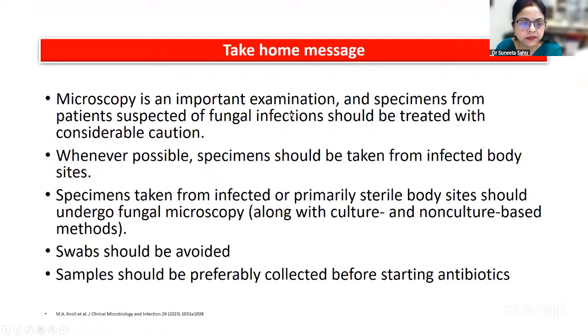Now, the take home message is microscopy is an important examination, and specimens from patients suspected of fungal infection should be treated with considerable caution. Whenever possible, specimens should be taken from infected body sites. Specimens taken from infected or primary sterile body sites should undergo fungal microscopy along with culture and non-culture based methods.